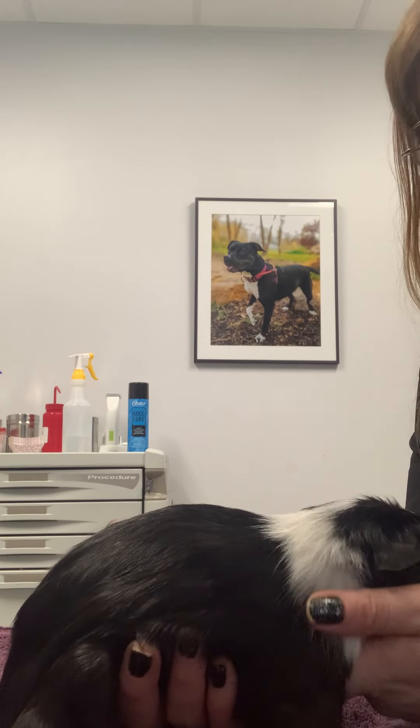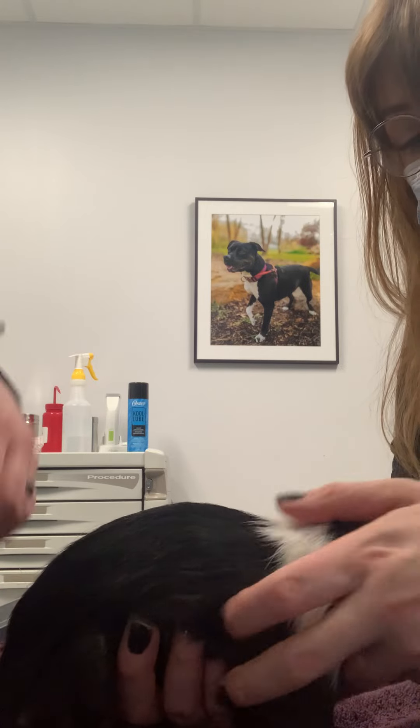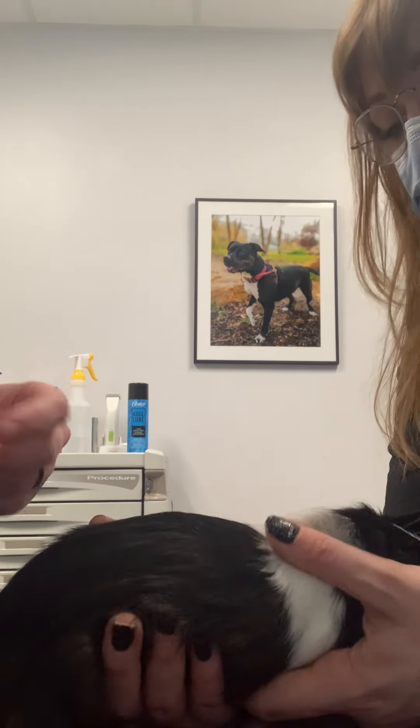Now we're going to give some subcutaneous fluids to the guinea pig here. It'll be the same technique as with our rabbits, ferrets, dogs, and cats.